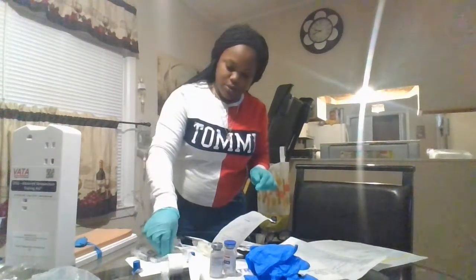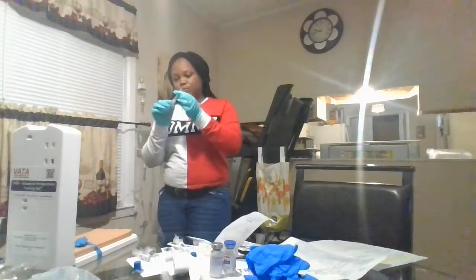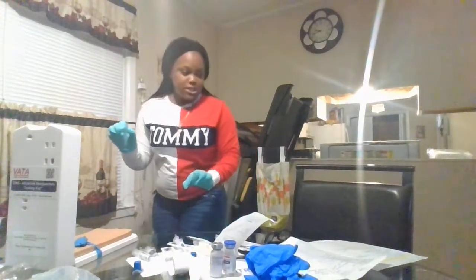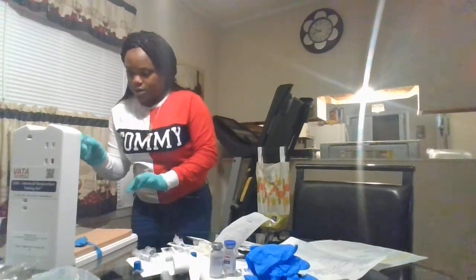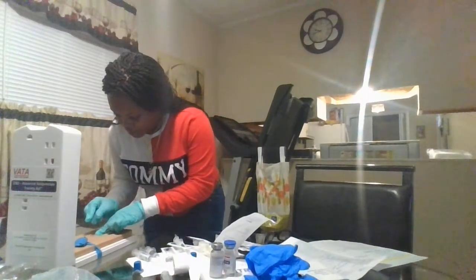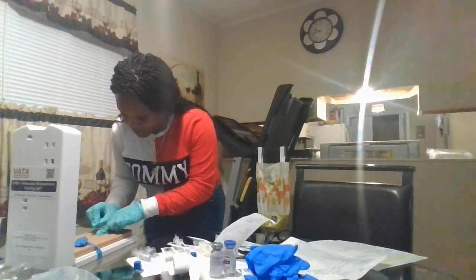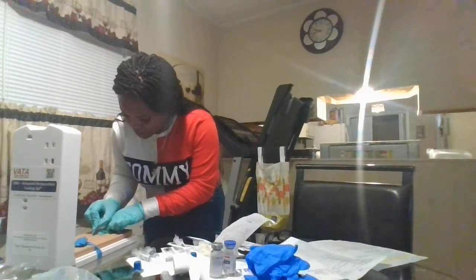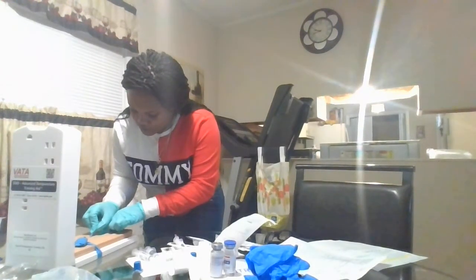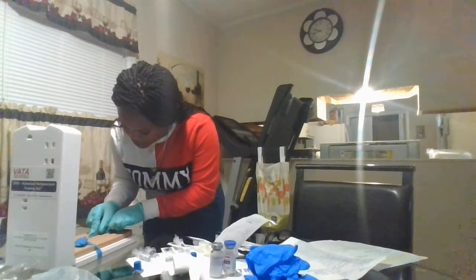At this point, I'm going to get my catheter and remove the top off it. All right, now, Mr. Jack, you're going to feel a pinch as I insert the catheter into your vein. I'm going to pull back to make sure everything is working properly. Going in at about a 10 to 15 degree angle. Checking for a flash. I have my flash.